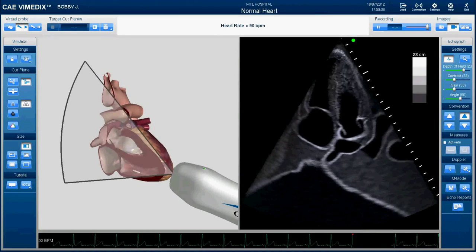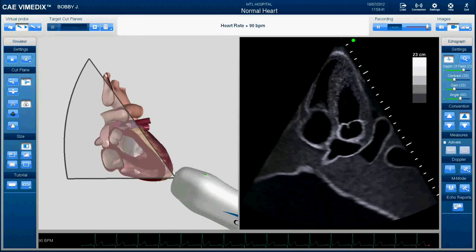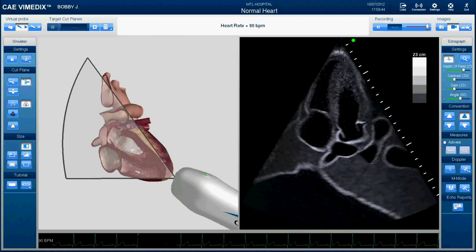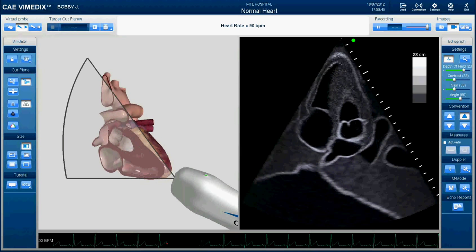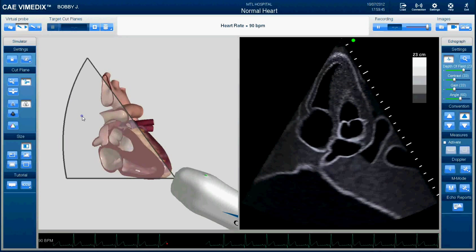Because there are essentially infinite ways to hold the wand and infinite views of the heart, we've established some standards to give people a frame of reference for getting oriented when they look at an ultrasound view. The view presented here is called the apical long axis view. It's called apical because the tip of the wand is on the closest part of the sternum to the apex of the heart. This is the longest slice through the heart you can get, so it's on the long axis — the apical long axis view.